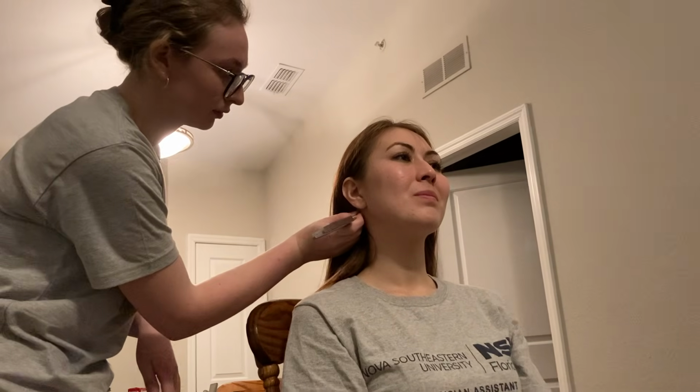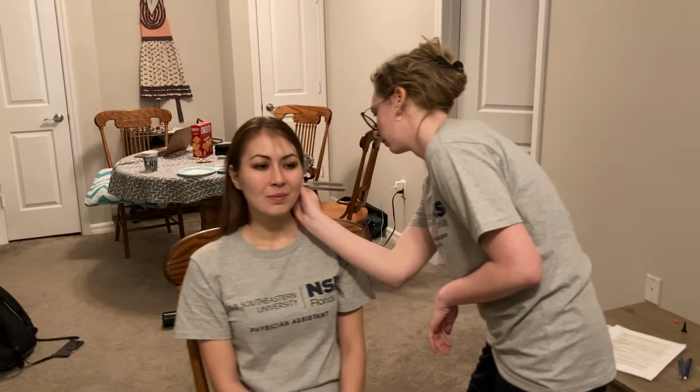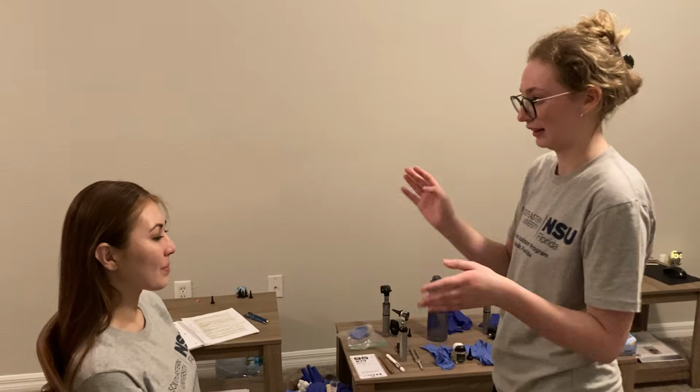So I'm going to activate this and put it on your mastoid. And you're going to tell me when you stop hearing it, and then I'm going to put it up to your ear, and again, you tell me when you stop hearing it. Do I hear it? Stop. Perfect. Okay, same with this ear. It's gone. Great job. Okay, so the Rinne test is indicative of air conduction being greater than bone conduction bilaterally.